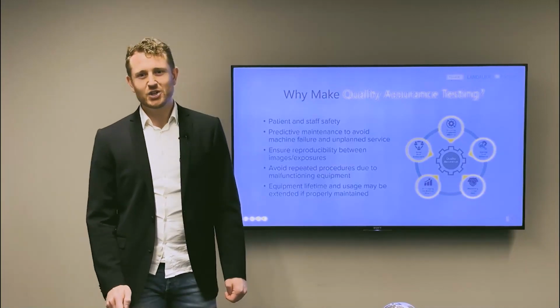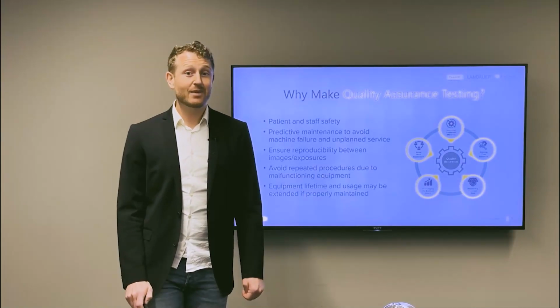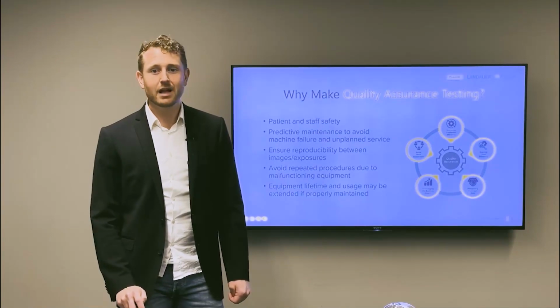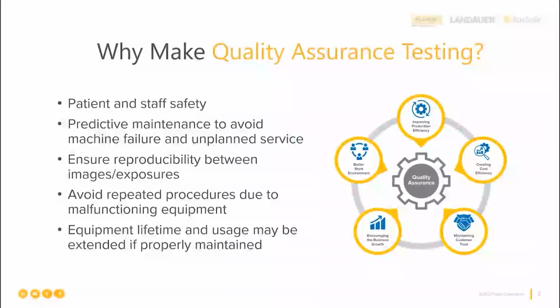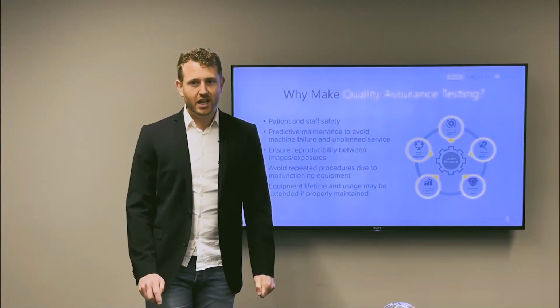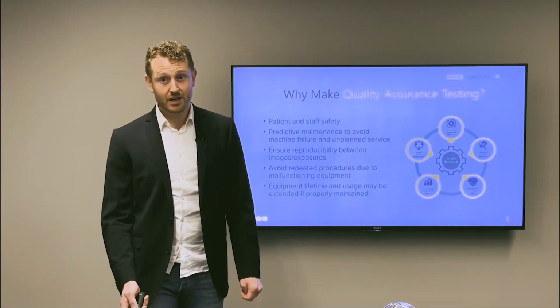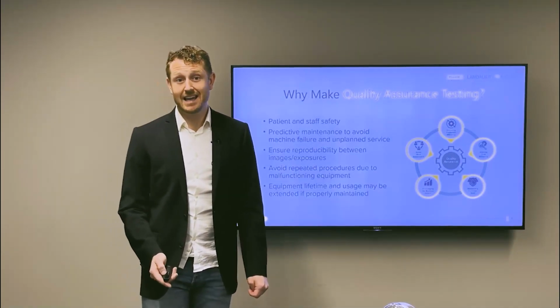But why do we need to do QA measurements? Quality assurance tests are first done to establish measurement references, and thereafter they serve to uncover possible malfunctions or wear and tear problems in the X-ray machines over time. As we will see, there are several problems that can occur in the X-ray machine which regular quality assurance testing can detect at an early stage. Malfunctioning of an X-ray machine is not only expensive due to new parts and downtime, it can also lead to increased dose to both patient and staff.